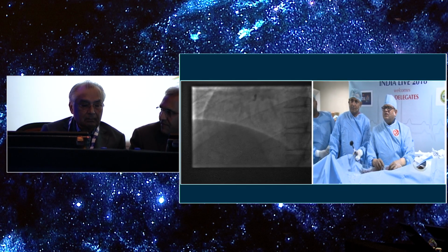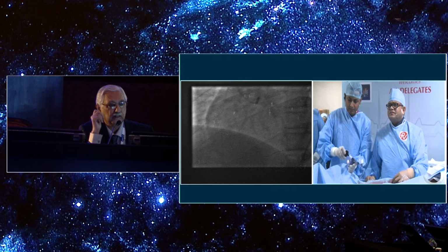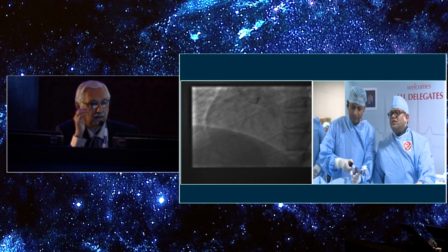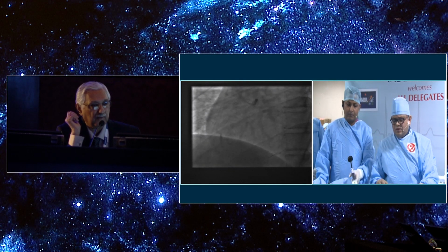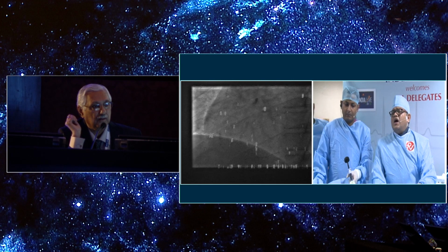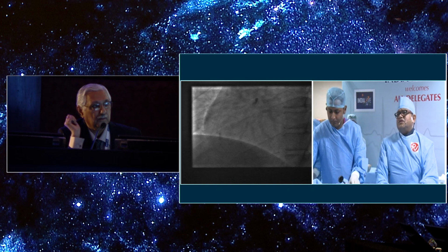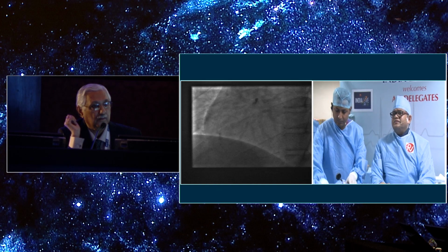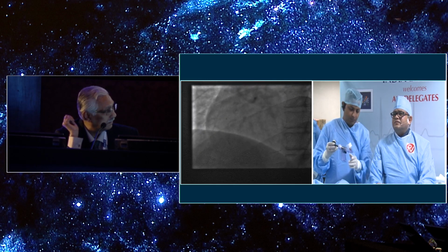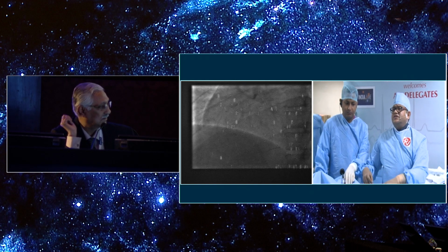What is your option regarding the guide cath as suggested? Whether you go for the Judkins right 3.5? I think I would go along with what Dr. Kirti Punamaya has suggested. A Judkins right with a guideliner would be a very safe and very stable option. Ajit, what is your comment? See, I have not used the JR guide.